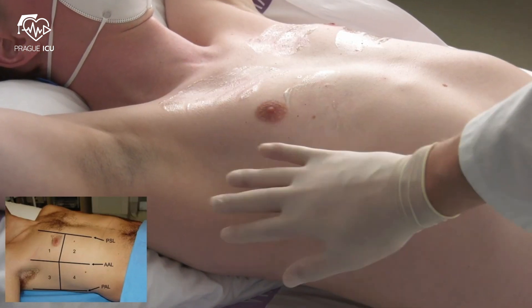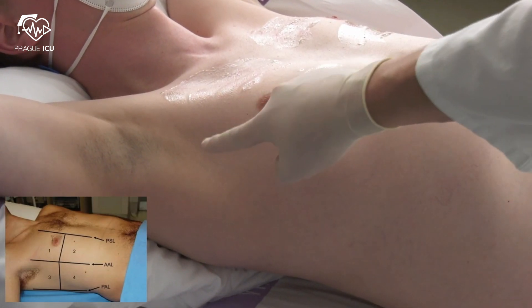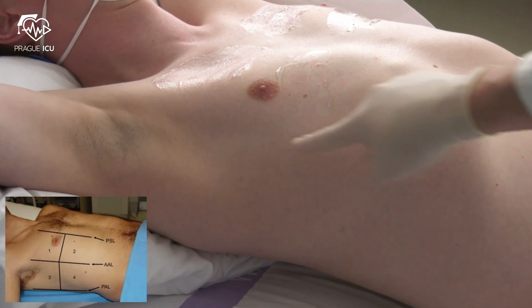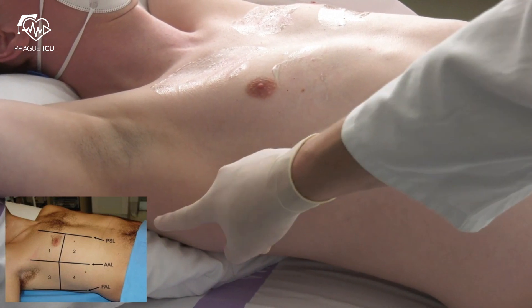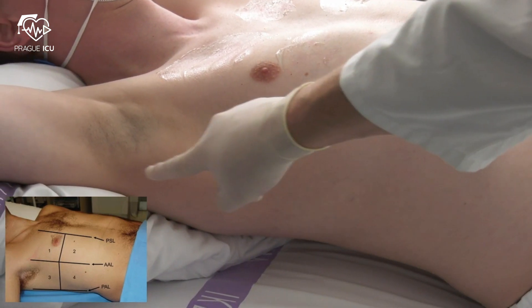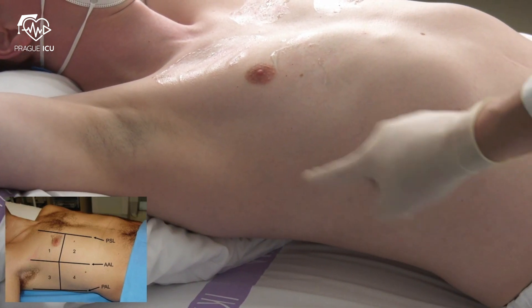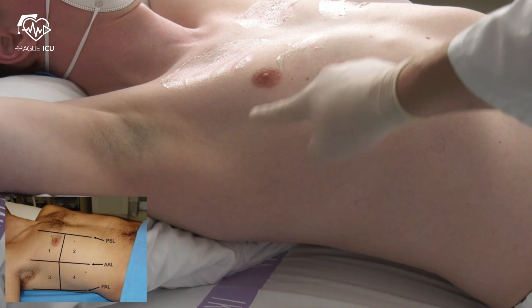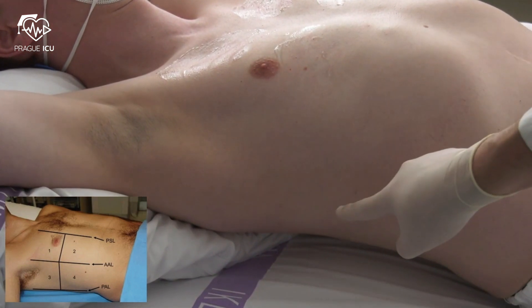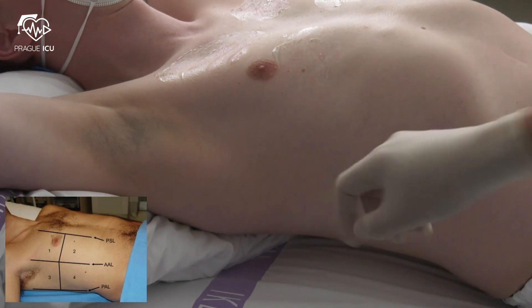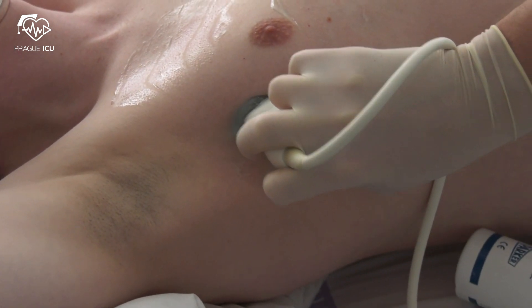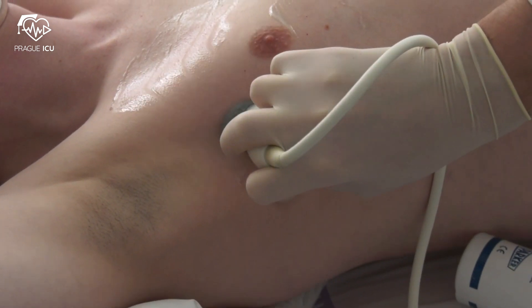The lateral lung zone is divided by the anterior and posterior axillary lines. Again, the nipple separates the superior and inferior zones. We look for lung sliding and A-lines as markers of aerated lung.